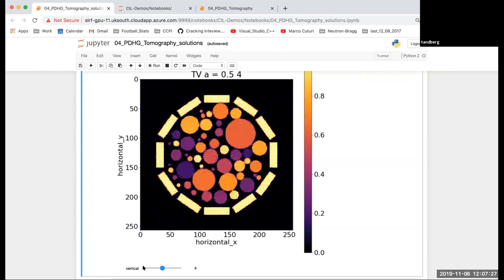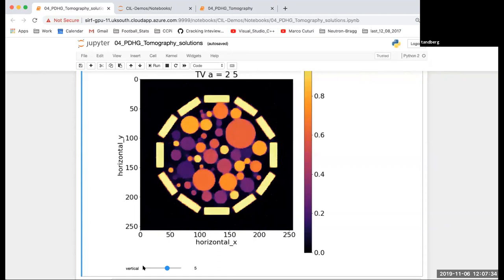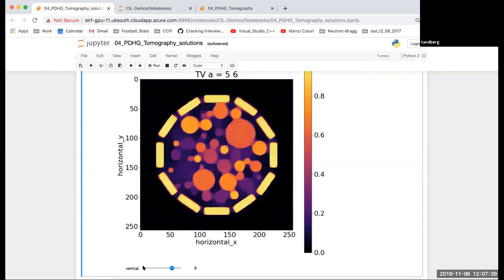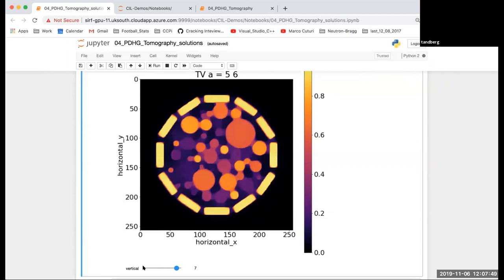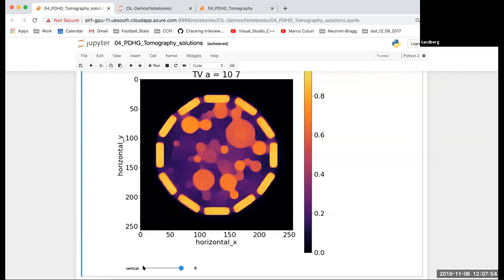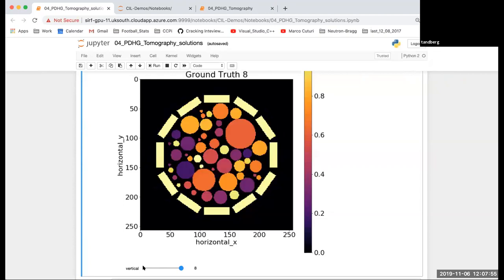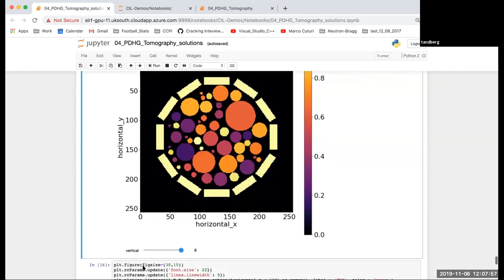The optimal is 0.5 in terms of PSNR values, and then as you increase the regularizing parameter you start losing details from the contrast from these circles. Eventually, you lose a lot of details from this one compared to the ground truth.